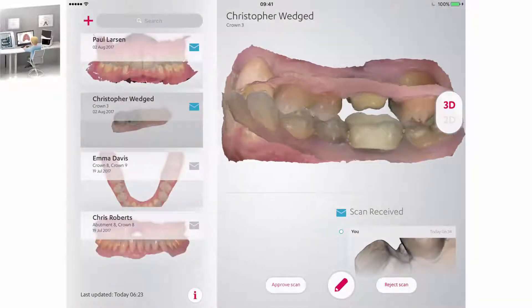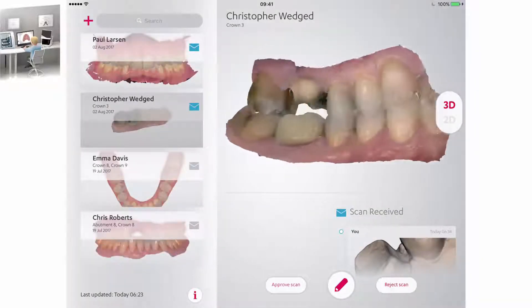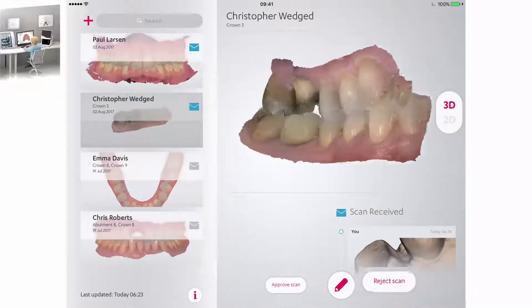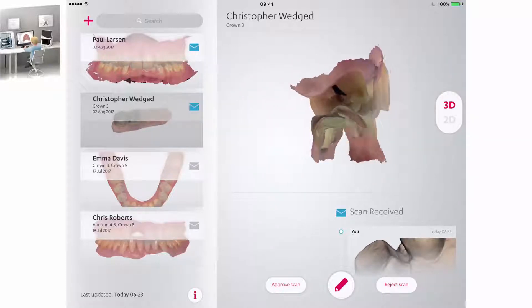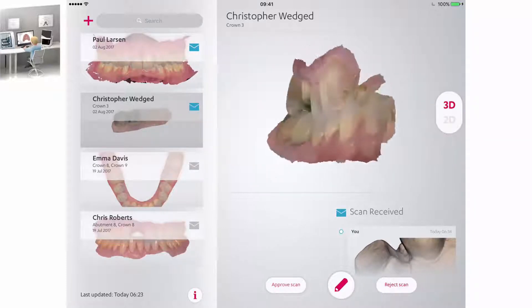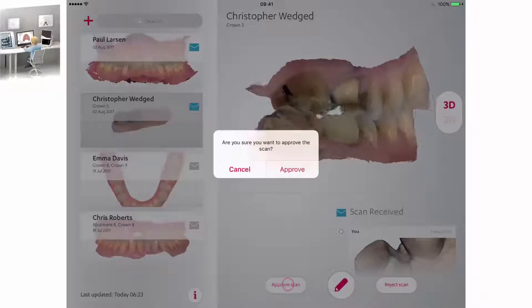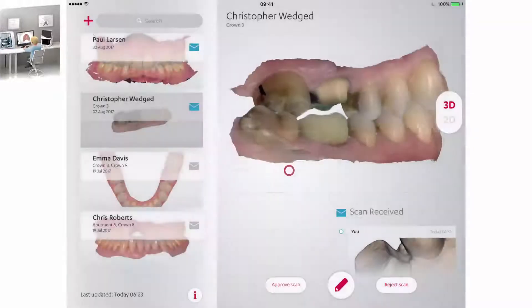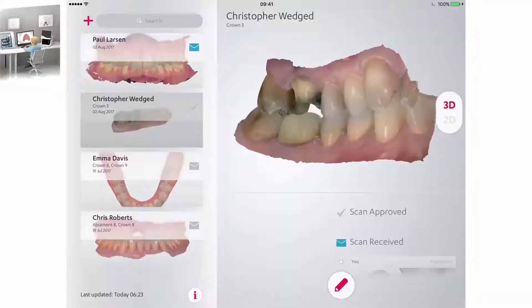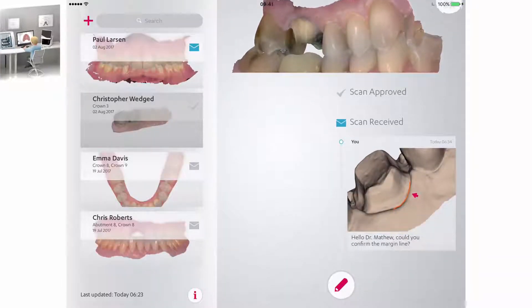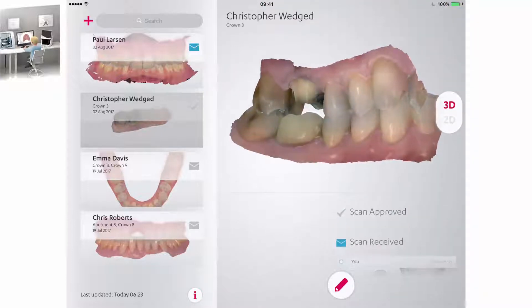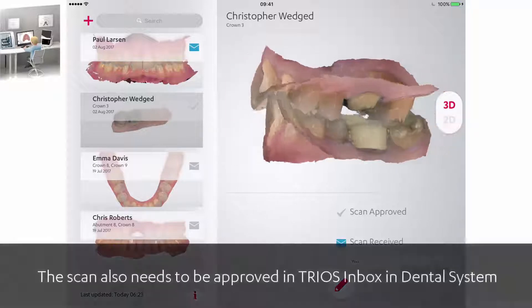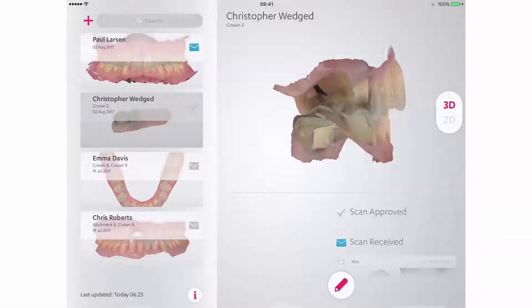The lab user that the case has been sent to will notice two buttons below: approve scan and reject scan. You can now approve or reject the scan. If the comments added do not disqualify the case, it can be approved. A pop-up will appear prompting for confirmation of your approval. When you approve, you will get a notification that the scan has been approved below the 3D view. Remember that in order to work on the case in the dental system, it also needs to be approved in the TRIOS inbox.